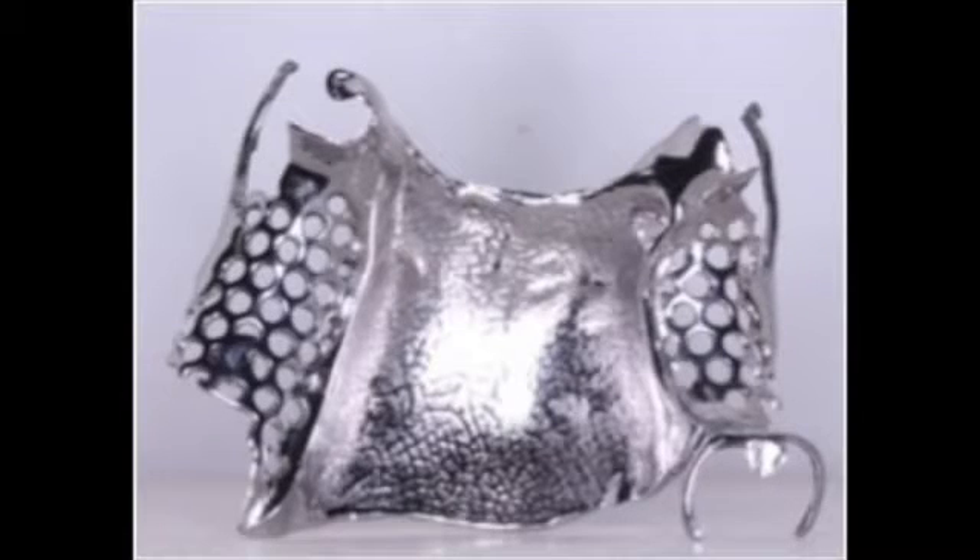Fitting of the framework is then carried out. At this stage, the technician carefully seats the metal framework on a duplicate master cast and tries to identify areas that prevent seating of the framework.